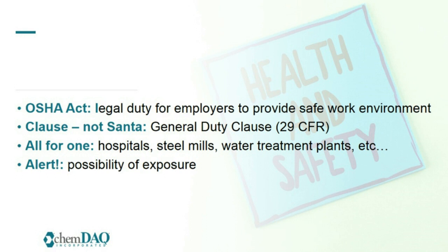Another example is the ethylene oxide standard, ETO. It calls for alerting employees where there is a possibility of an employee exposure due to ETO in an emergency, and should alert them promptly. Affected employees should be immediately evacuated from the affected area. This is really a big deal.